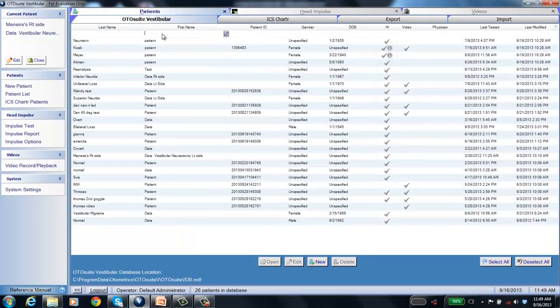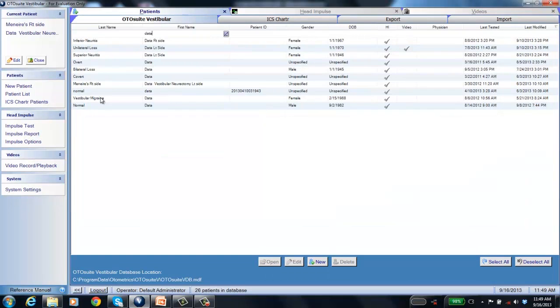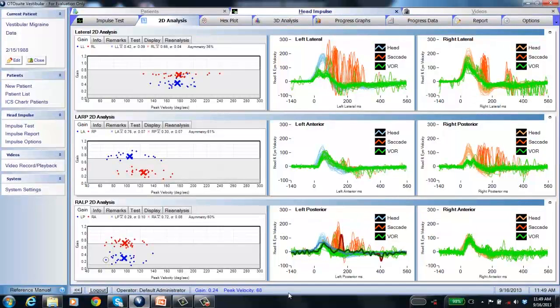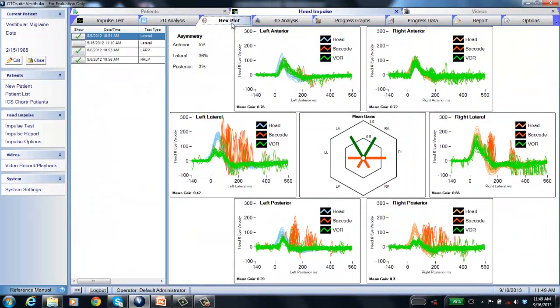Looking at a vestibular migraine patient: the results show lateral disorder with right posterior and left posterior involvement. This pattern doesn't match superior neuritis (which would be anterior and lateral) or inferior neuritis (which would be posterior only). Vestibular migraine patients can vary in their results. In the hex plot, the lateral and posterior canals are abnormal while the anterior canals are normal — an unusual pattern that may help with diagnosis.